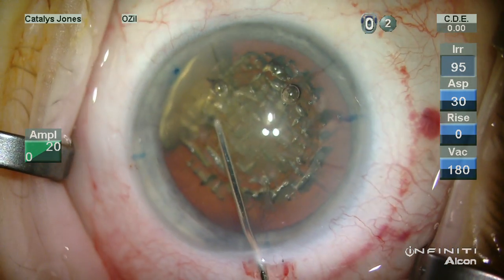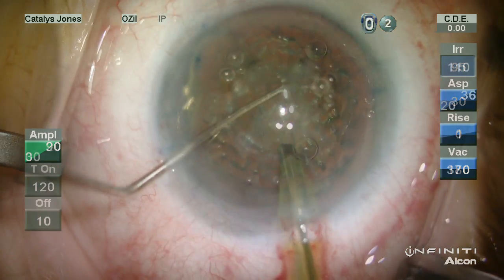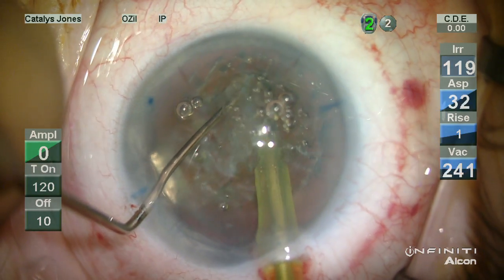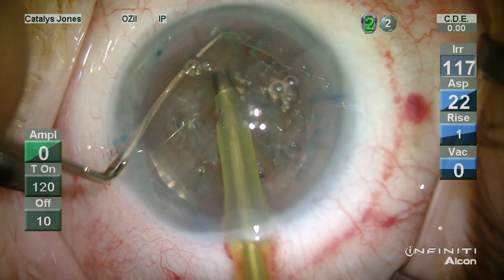Hydrodissection is very normal here with a good mobilization of the nucleus. I employ a chop technique using a standard vertical chopper.